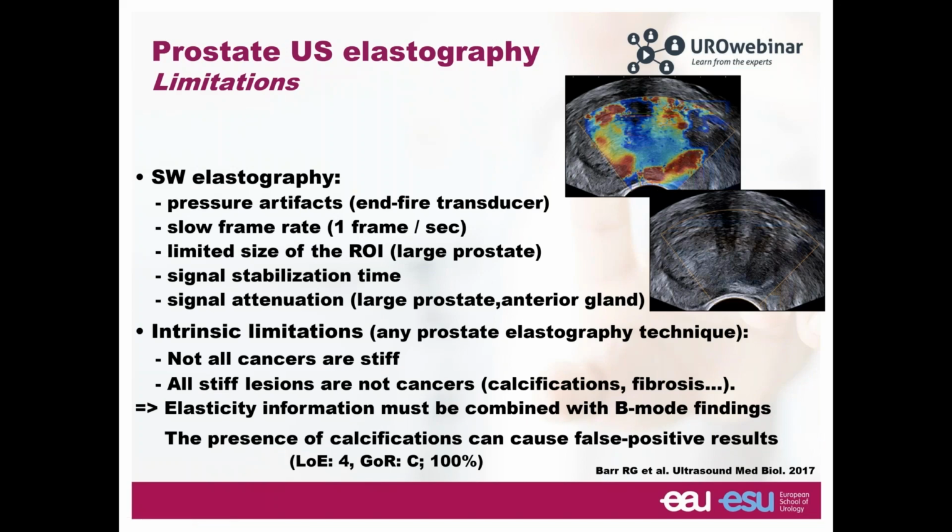So shear wave elastography is not magic, of course. It has some limitations, including pressure artifacts, and this is particularly true when the prostate is getting bigger and pushing on the rectal wall, the slow frame rate, limited size of the region of interest for large prostates, and signal attenuation in very large prostates or the anterior gland. However, it provides very good and very interesting results compared to conventional B mode imaging of the prostate.